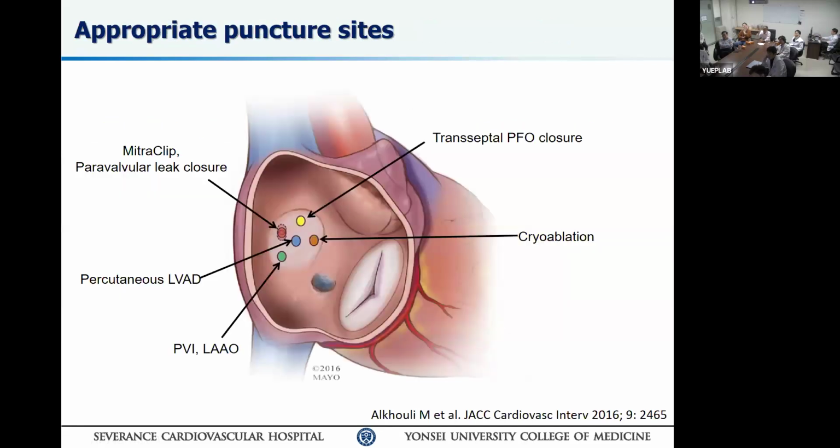Yeah, so you know where you want to go, and then it's up to you. Now, in my case, if I want to go to the RIPV, which is a more posterior vein than usual, I want to do a more posterior puncture. I don't want to do an anterior puncture, because if you do an anterior puncture, you have to come around, turn around. That makes it very difficult to manipulate your catheter. So it should be a little lower and posterior, for the posterior RIPV. Look at the CT scan and it will tell you, and so on. So the most common reason that atrial fibrillation ablations and posterior septal catheter ablations fail is that the transseptal is too anterior. You cannot engage the catheter into that. So that's the reason. Okay, keep going.